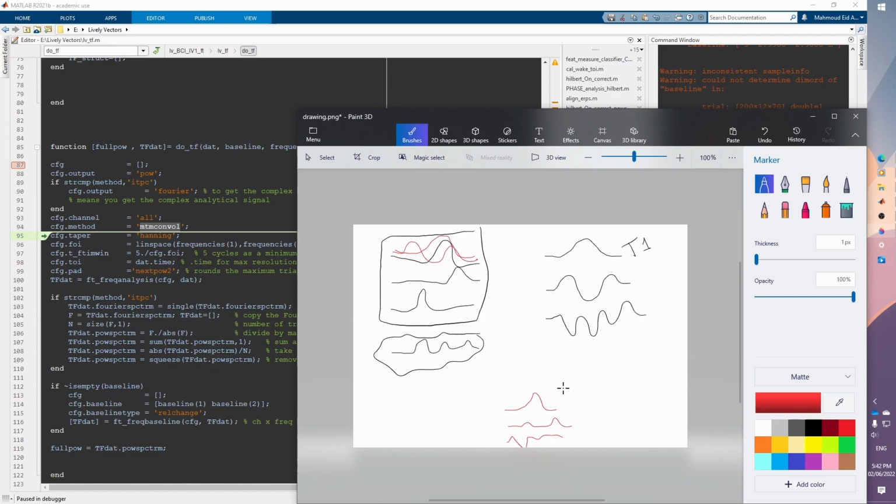And then we will end up with data that is now tapered, and we can get the Fourier transform for each one of them, so that we now know that our single signal is now tapered with multi-tappers, and each one of them is showing different behavior or interesting characteristics that are different from the other one.